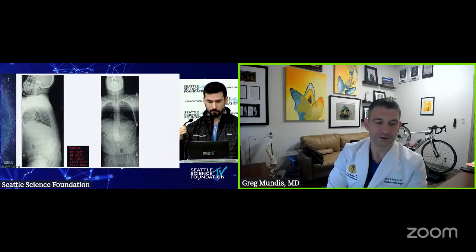So he's maximized his ability for pelvic retroversion, and then he's still failing on top of that. There's an angle that you can draw between C2 to the pelvis and then up to T9. And the larger that angle is, the higher the failure rate is with the lower thoracic endpoint. He's at risk of that. He's also got this inflammatory arthritis, which we have to take into play. And then we also have to think about bone quality.